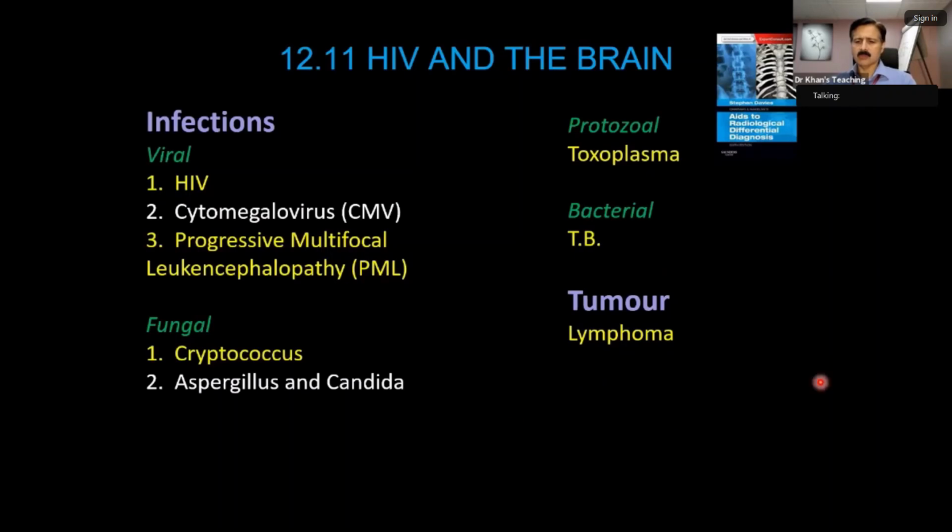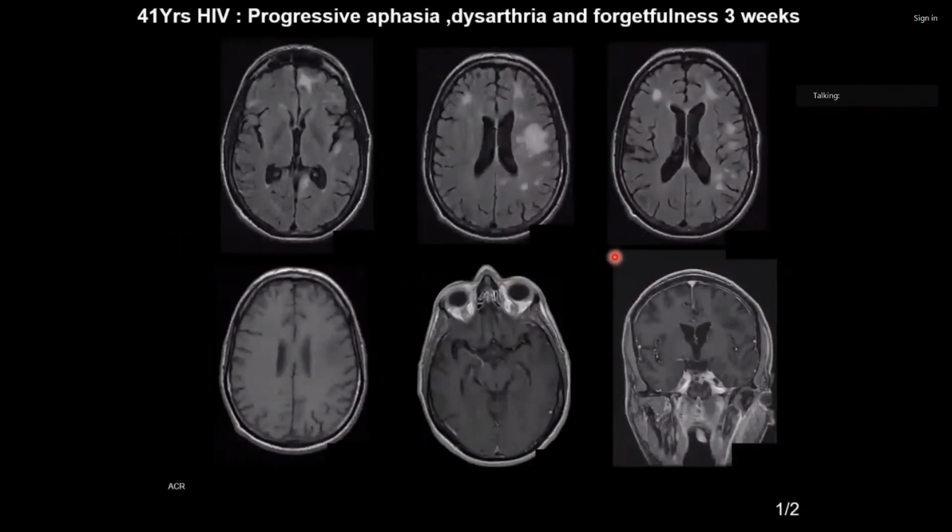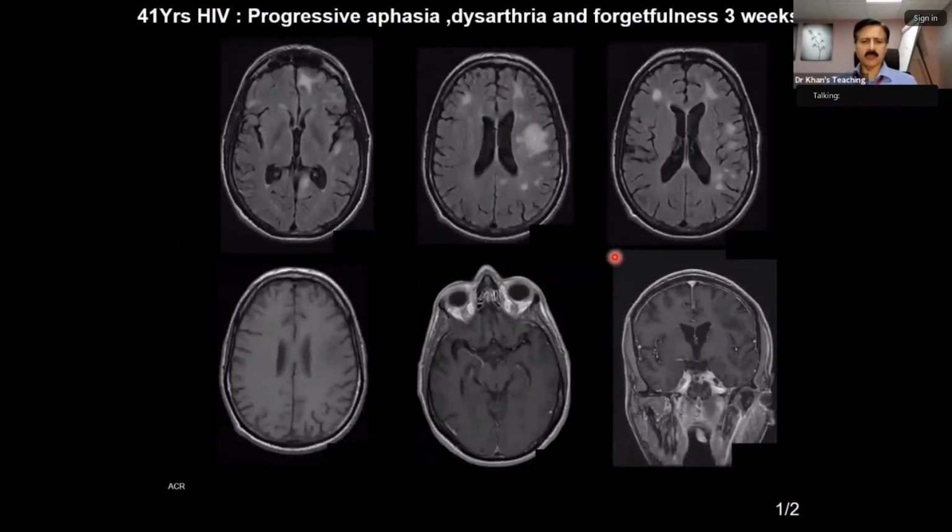So, hi. Okay, welcome candidate 4. This patient is a known case of HIV. There is neurological deterioration. They are worried. How will you tackle this? Please remember that there is no enhancement. Because of time factor, I am going fast, so I'm sort of telling you a few things in a leading fashion.